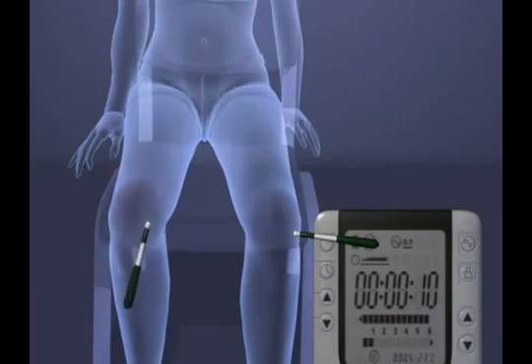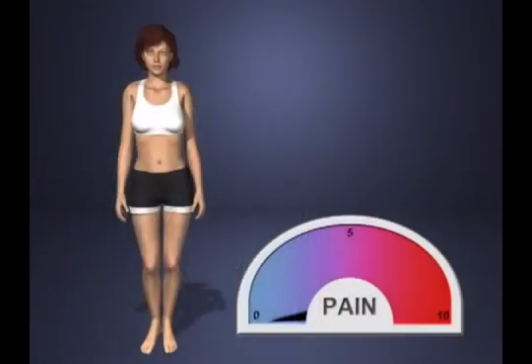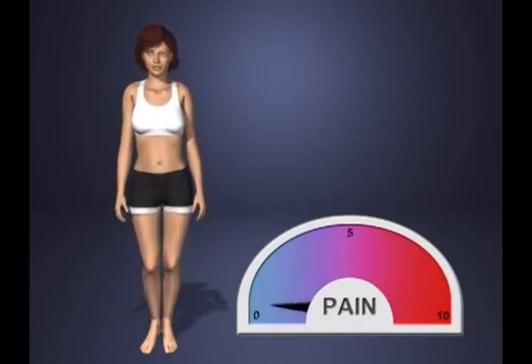For best results, vary the probe placements until the pain is completely gone or maximum relief is achieved for that day. There is usually an increased range of motion in treated areas. Finish with cranial electrotherapy stimulation.